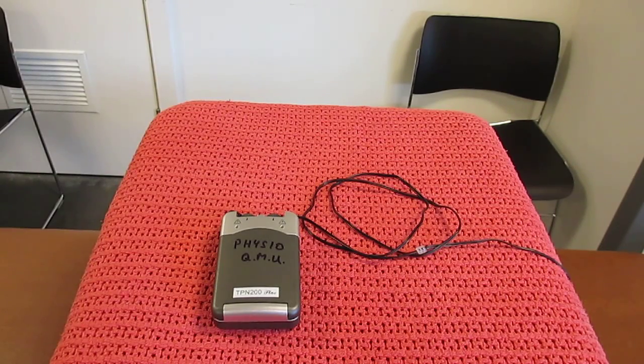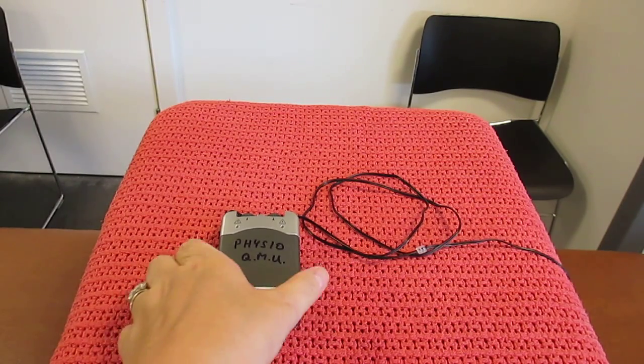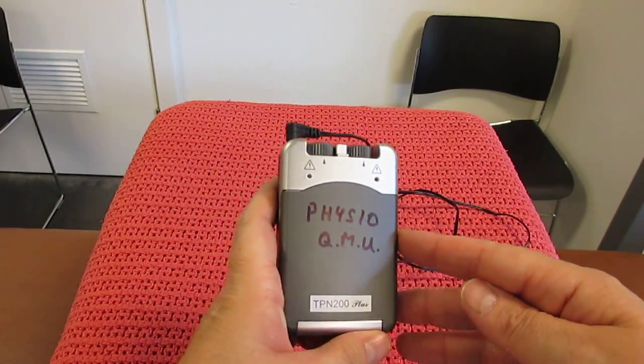Having placed the electrodes on the skin of the treatment area, you would then select the frequency or repetition rate.